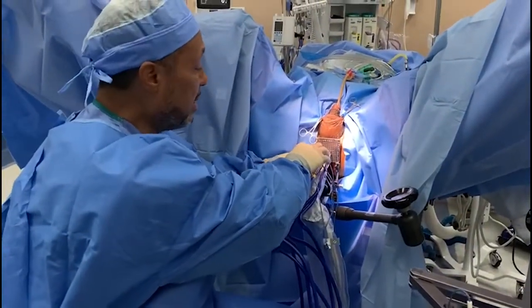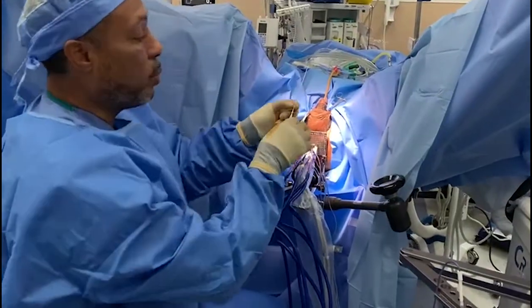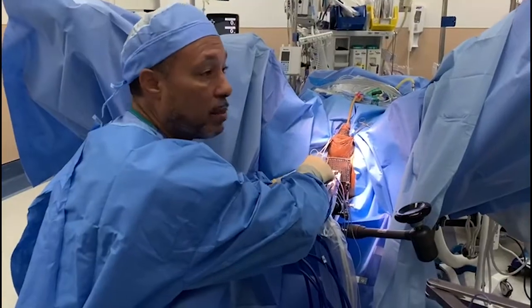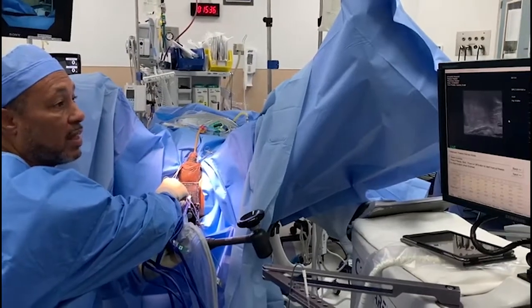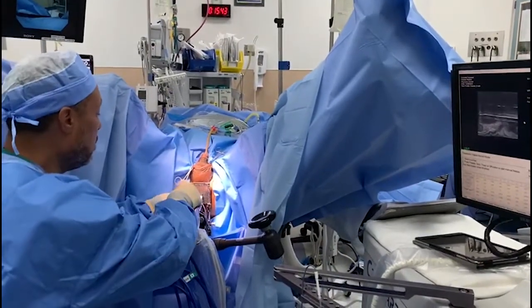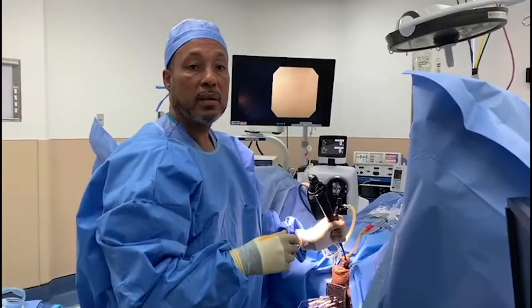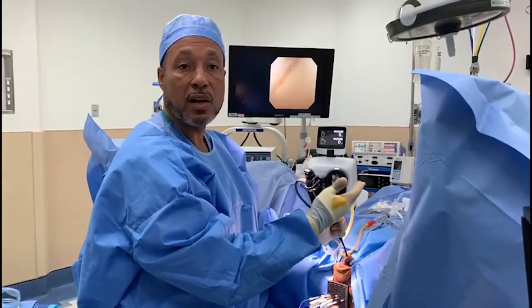I place the thermocouplers where I believe the neurovascular bundle is. We then place probes surrounding the prostate apex, external sphincter right, and lateral neurovascular bundle. One important thing is to make sure the catch — the stopper that secures it to the grid — is properly engaged, as it sometimes sticks. I place it probably mid-gland, as far to the side as I can. Next step is to place a guide wire, then place our warming catheter over the guide wire and into the bladder, and then we'll start our freeze-thaw process.